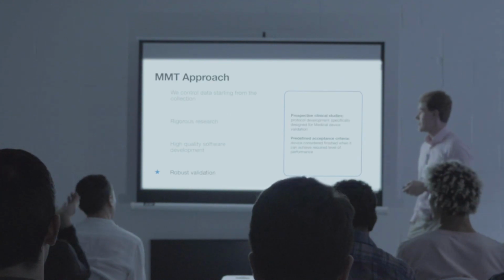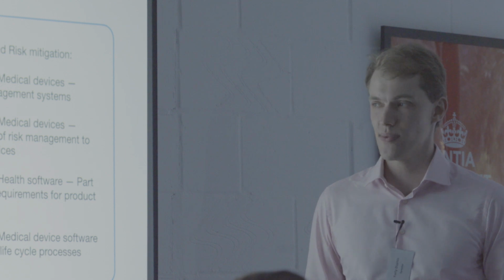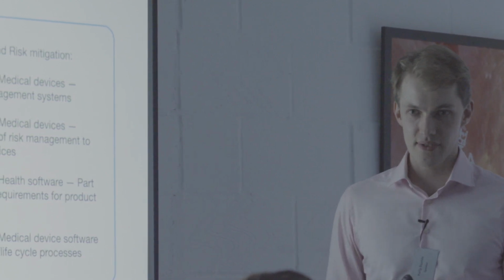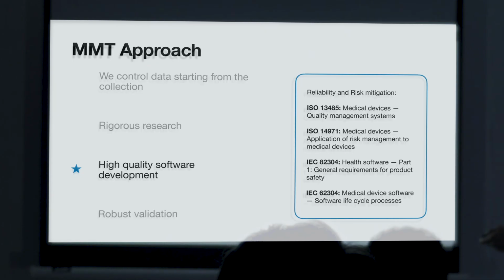Yeah, so what we talk about here, because I talk about software development, our devices are purely software. We don't have hardware. Even if you have an app, it will still be software, because your phone is not part of the medical device. So what we do is software as a medical device.